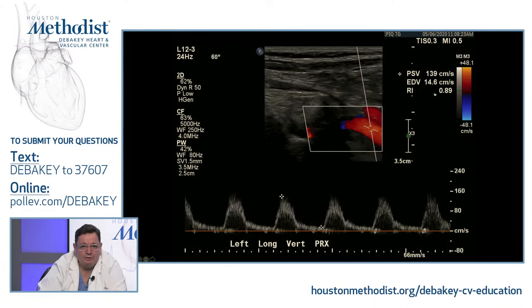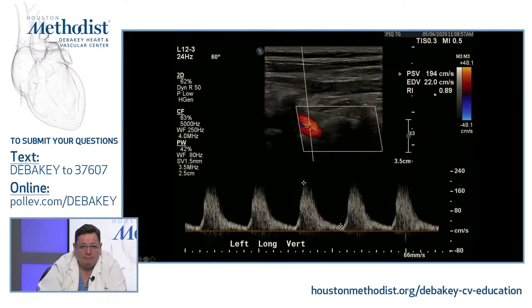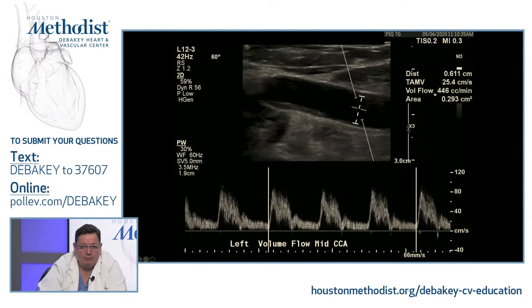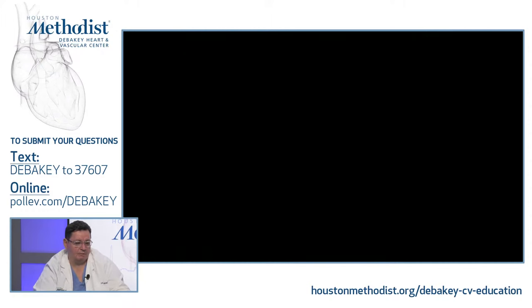That vertebral's increased velocity and the flow volume on the left side is 446 cc/min — definitely four times more flow coming up on this side compared to the right. So the left vertebral has a huge role feeding not just the retrograde vertebral on the right but most likely contributing to both anterior and posterior circulation.